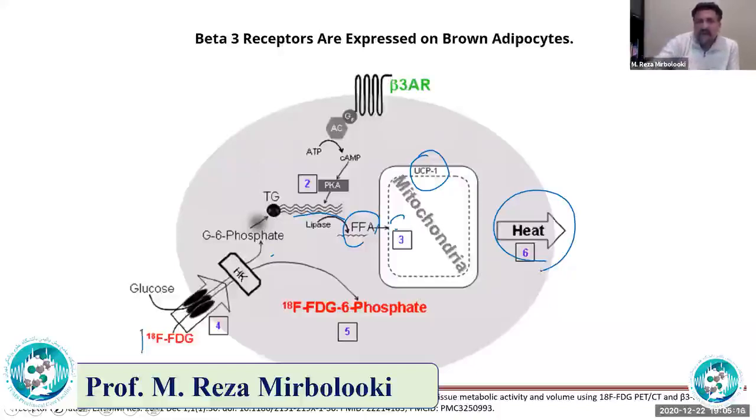In this series of experiments, we used F18-FDG. FDG is an analog of glucose labeled with fluorine-18, and it shows that the metabolism in that cell goes up. It's a very common radioactive analog of glucose that is also used for finding cancer metastases.